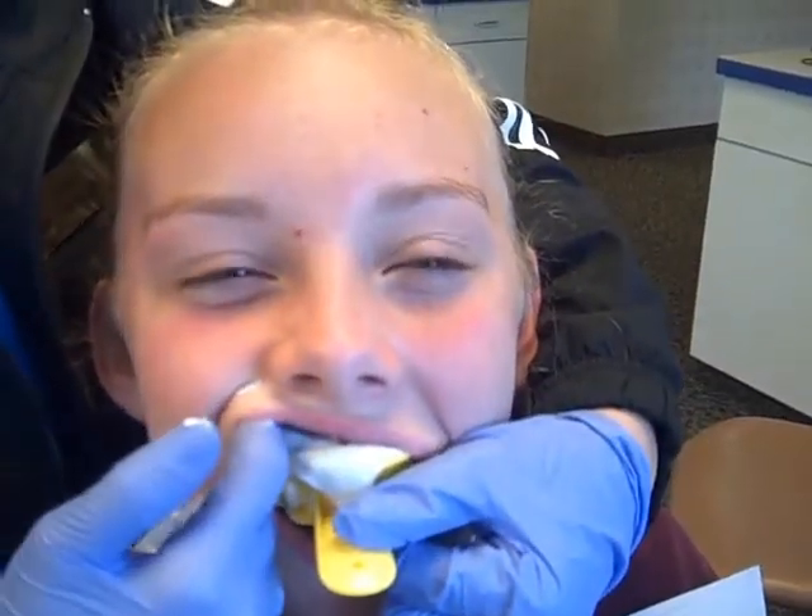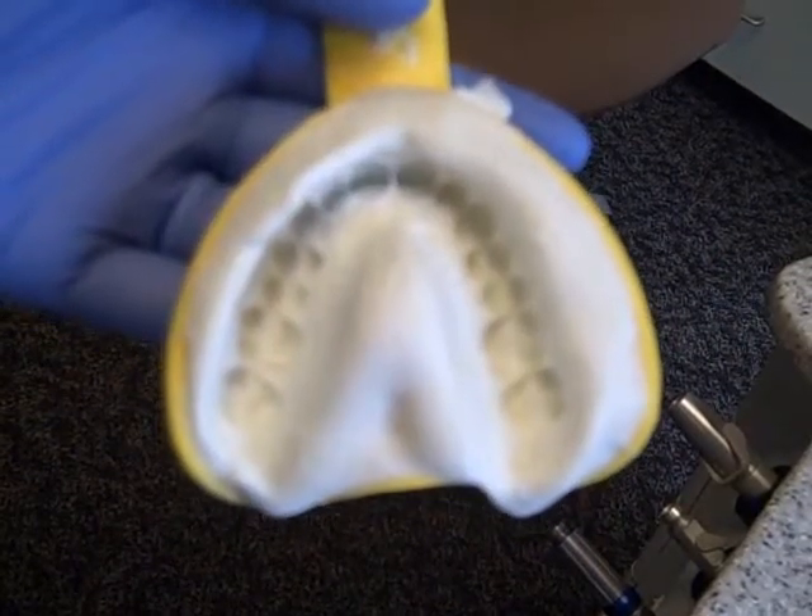I'm just going to take it out now, going to go up by your cheek. There we go. And that is all there is to taking an impression.